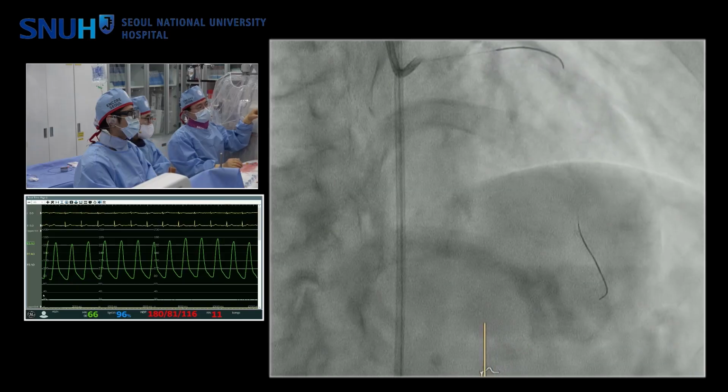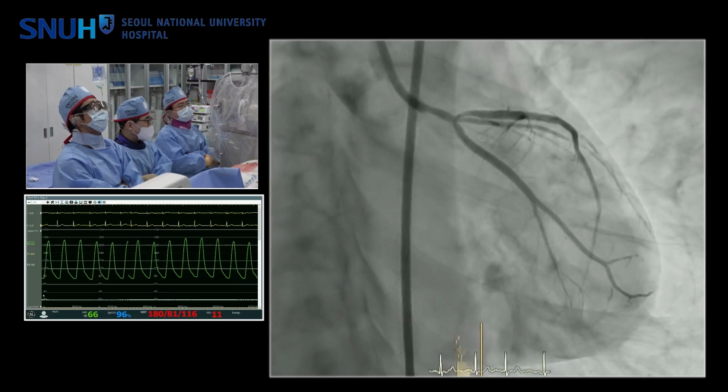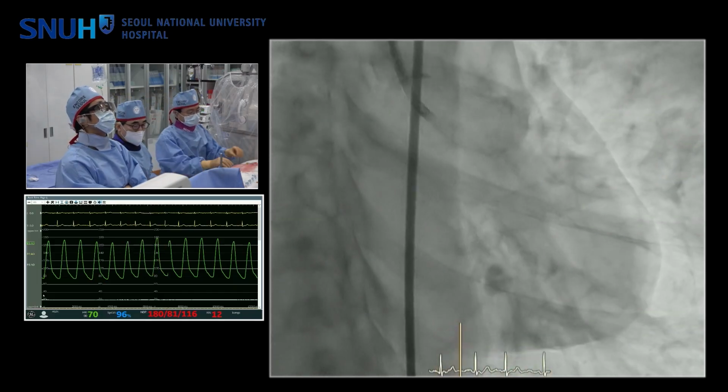Okay, please continue discussion while we are doing our procedure.